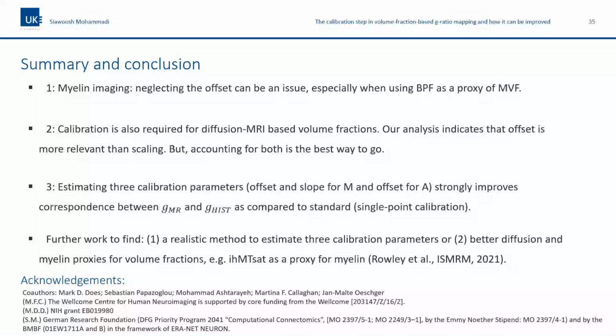Well, our approach was, we know it will be different, but we are fitting all those parameters. So that we'll still get the G ratio that you'll measure ex vivo by having the tissue fixed to some extent. Because yes, it's true the relaxation parameters will change, but we are fitting them. So they are another parameter of our model.